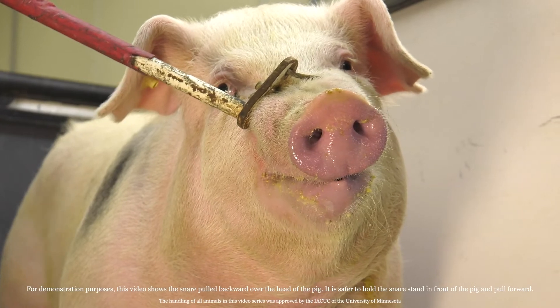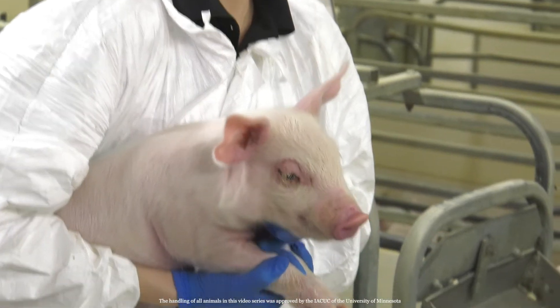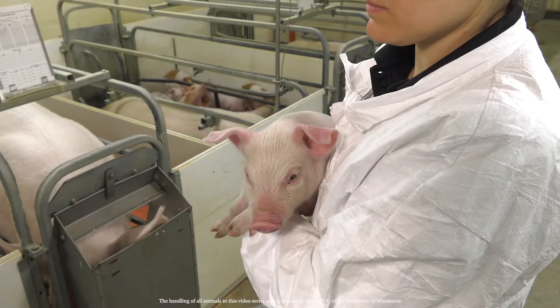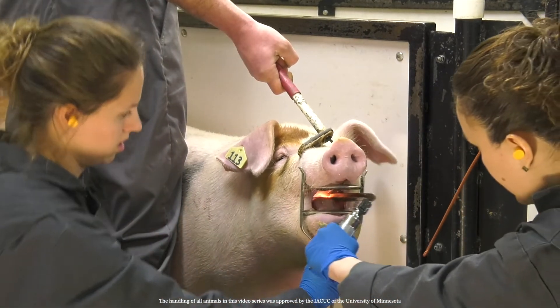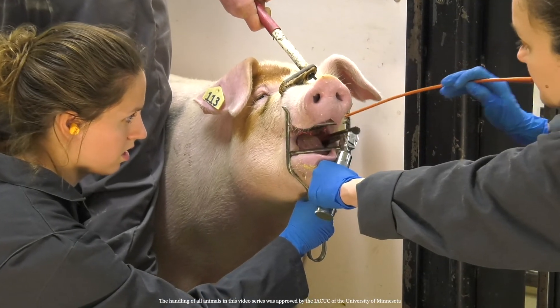Place the snare around the pig's snout, behind its upper set of teeth. If you're sampling a piglet, have one person pin the piglet under their arm using their hand to support the breastplate. The other hand will be used to control the piglet's head, allowing the other person to collect the sample. Once the pig or piglet is under control, insert the mouth gag between its jaws. Safely controlling the pig can often be a two-person job, so make sure you have help.